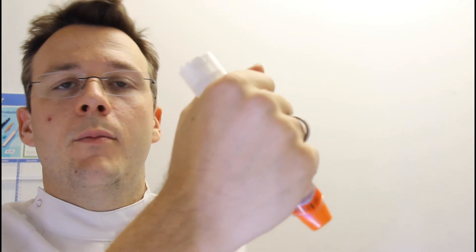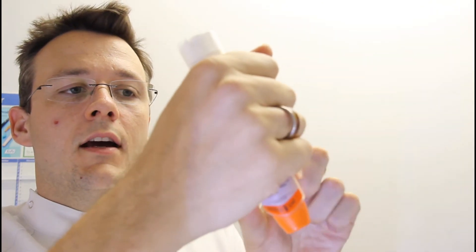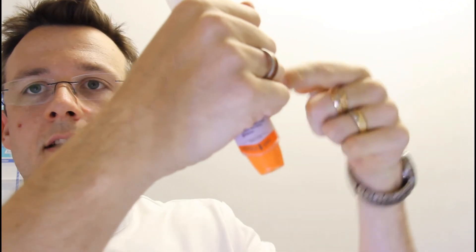There's a bit of a misconception that if they're wearing clothing, you have to push harder, like a Pulp Fiction to the heart sort of jab. You don't need to do that at all. The pressure's the same no matter what clothing they're using, because the pressure is actually just to activate the spring mechanism inside here.